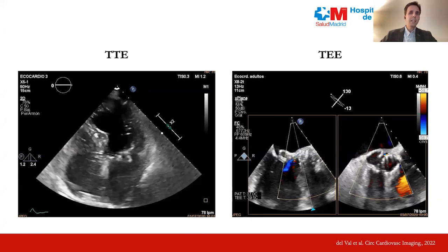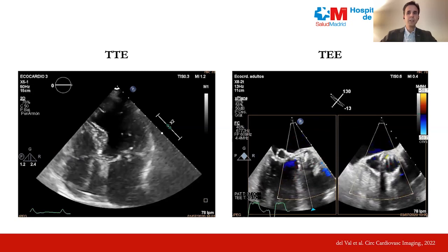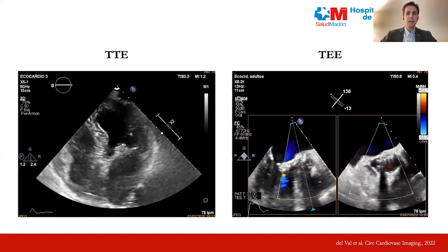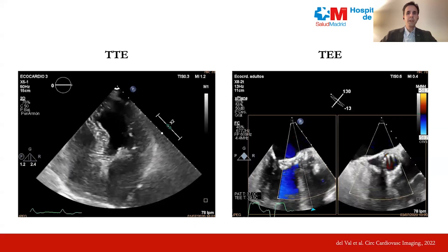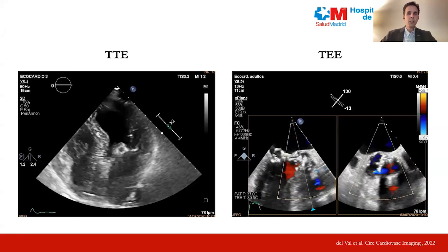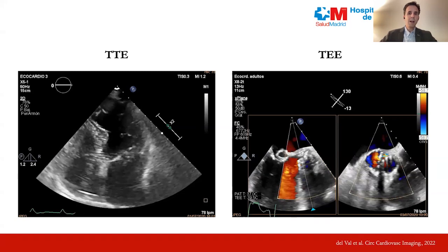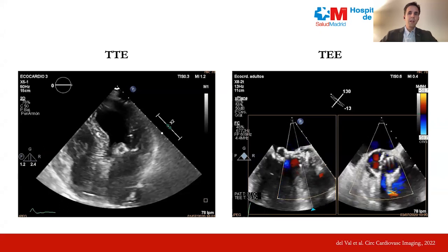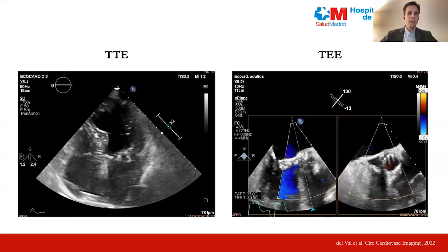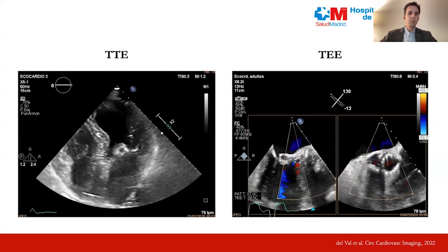And the TEE provided more details and showed a large pulsatile tunnel-shaped cavity that filled during systole, posterolateral to the aortic annulus in the mitral-aortic fibrosa, extending to the anterior mitral valve leaflet pseudoaneurysm. Importantly, there was no vegetation and there was no dysfunction of the TAVI prosthesis.